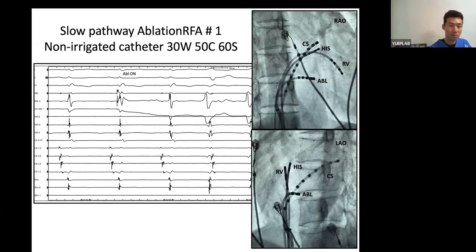How do I know that? Because the ablation distal has an early signal, and that's a subtle PVC, almost a crux PVC. You see that? Yeah. That is your catheter induced. Okay. So that is not a junctional rhythm, like Dr. Kim already commented.